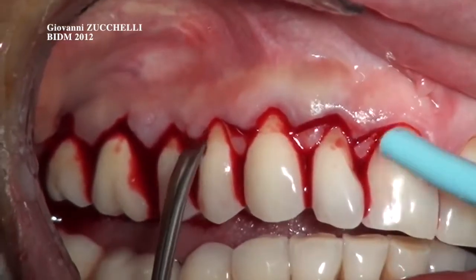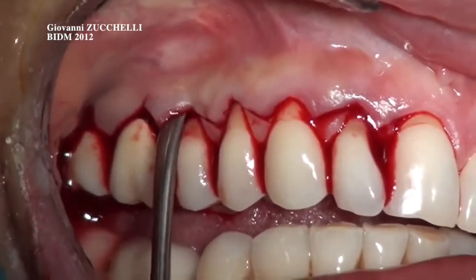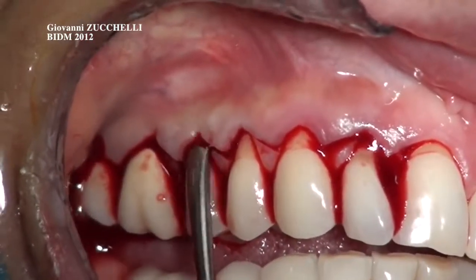And this is done for all teeth included in the flap design.